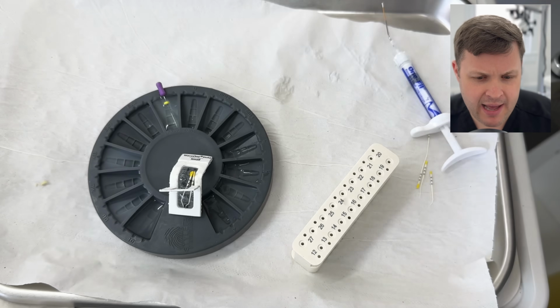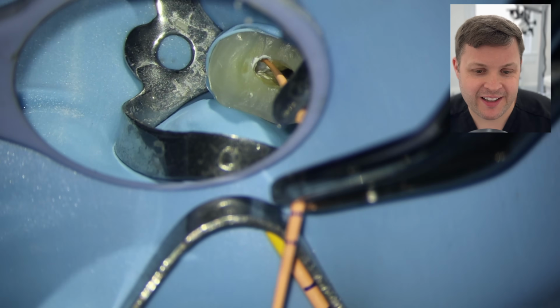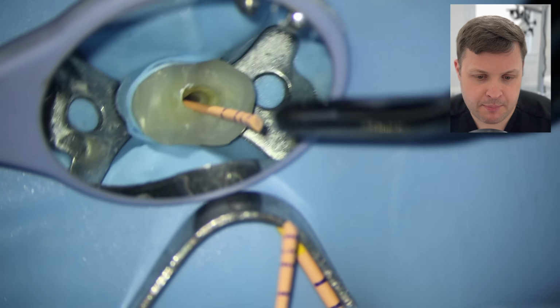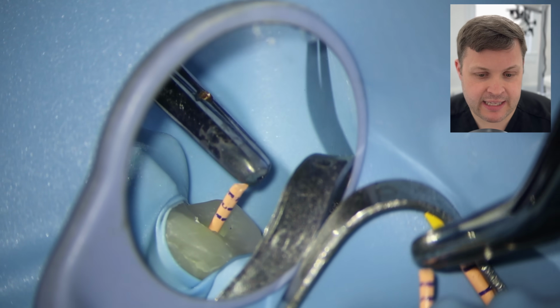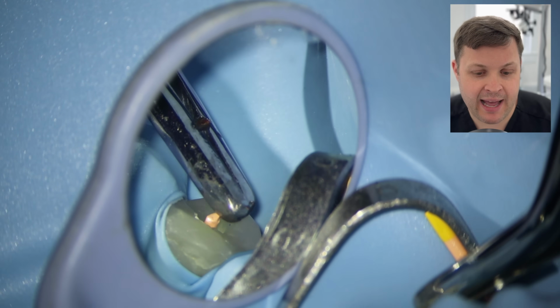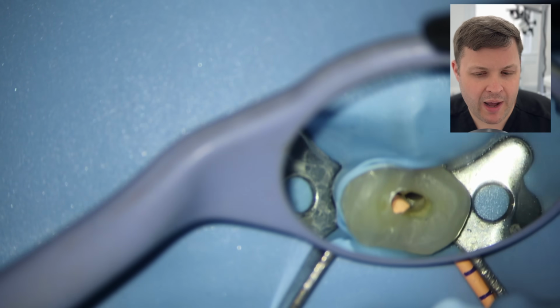I then pick up which I think is the Buccal cone. I start to place this GP cone in the Buccal canal, and the first thing I notice is that as I push this GP cone to length, it is going really, really easily. And in fact, I think that this GP cone is going past or beyond the mark where we've made. And I'm thinking to myself, why is this happening?